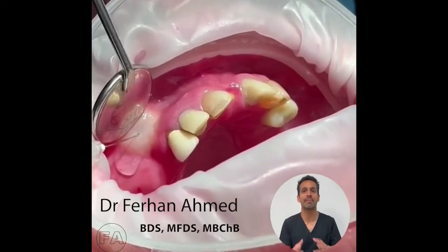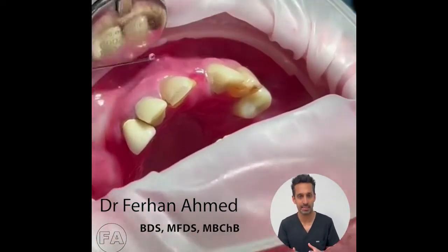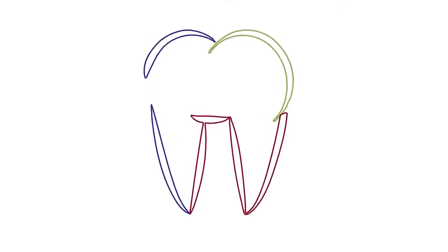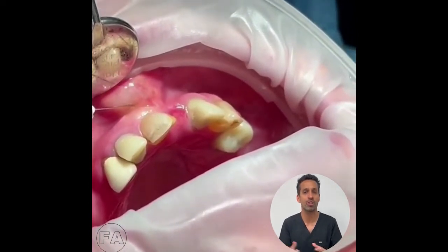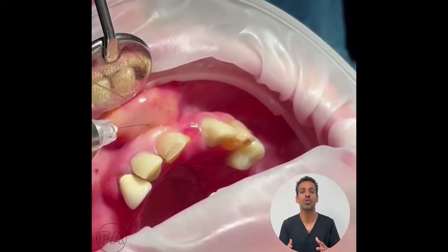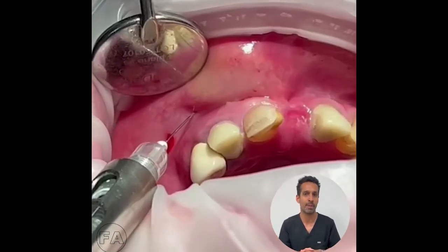Hi, this week's clinical tip. I'm demonstrating how to give local anaesthesia. A common challenge faced by many colleagues doing full arch implant treatment is loss of anaesthesia midway through a full arch implant treatment.